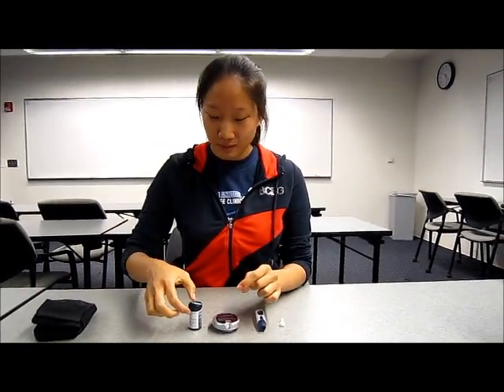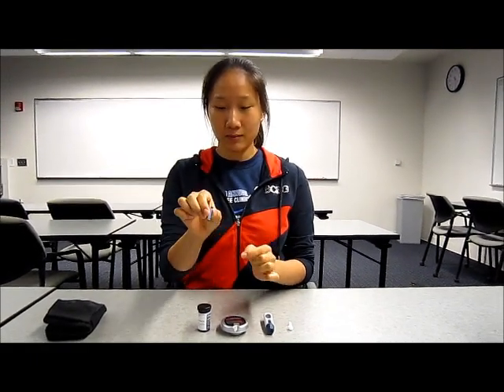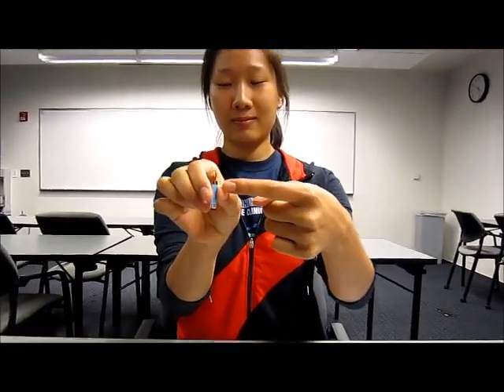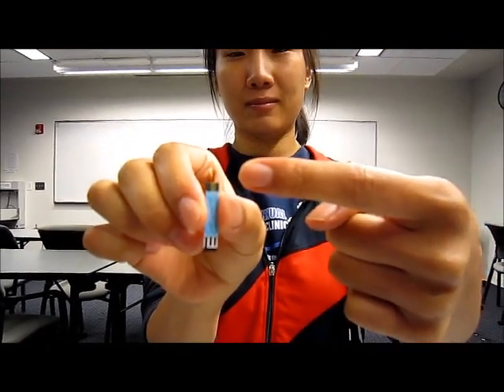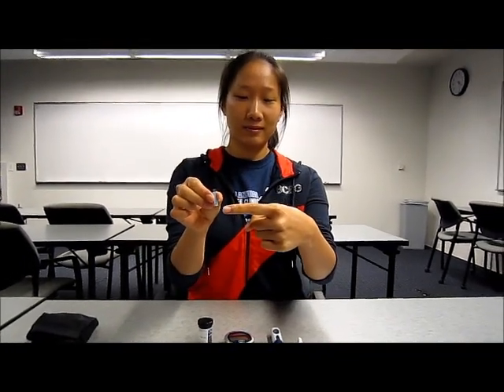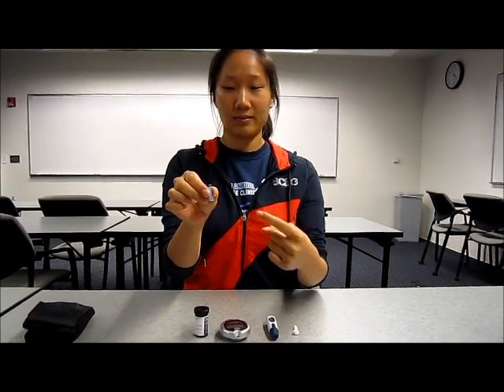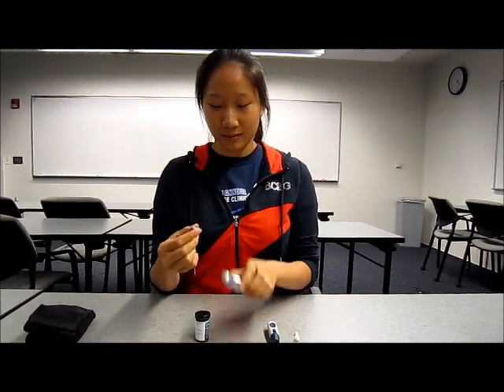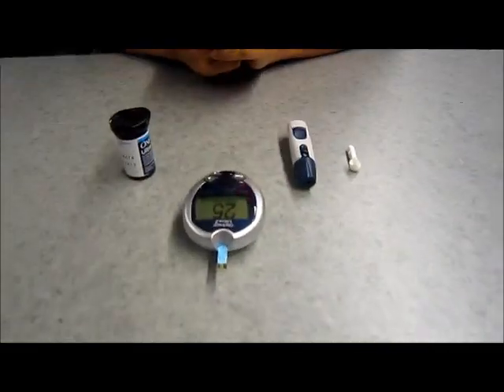The test strip is where you will apply the drop of blood. The top part, where you can see the yellow edge, is where the blood will be applied. It will drain into the reaction cell in the meter. The other end — the black end — of the test strip is inserted into the device. Push the test strip in until it is firm.